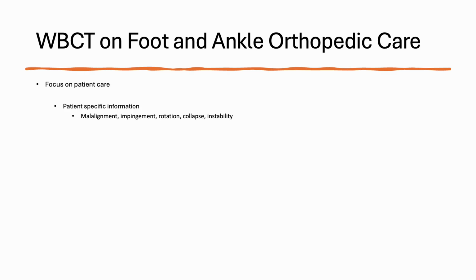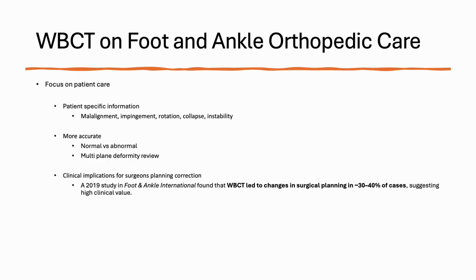And then those subtle Lisfranc, subtle syndesmotic injuries, I think I averaged roughly 250 CT scans over the last 3 years. So I use it quite frequently, and it can make you money if you're a private practice provider. It's more accurate, so you get normal versus abnormal pathology, right versus left legs, just like x-ray. You get multiplane deformity review, you get collapse, you get hindfoot valgus position, and like I said, if you have a 3D printer, you can upload those and get 3D printed models in real life.